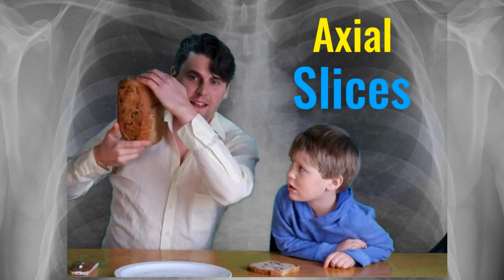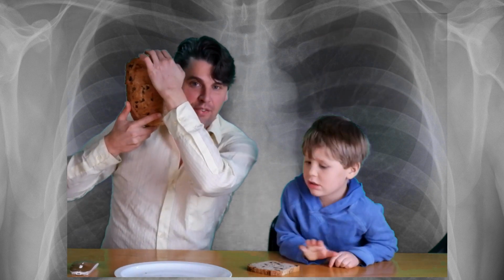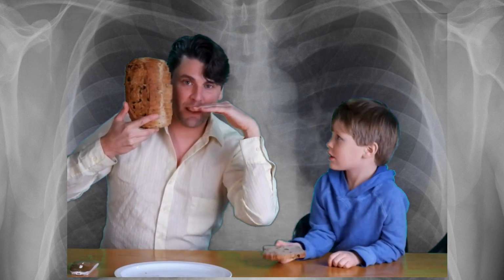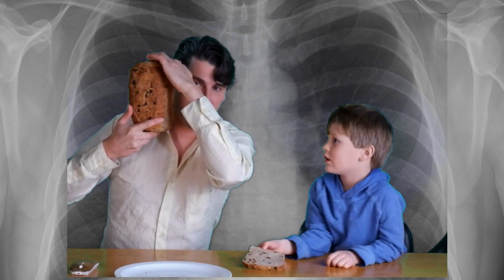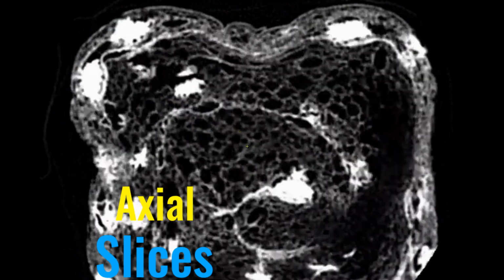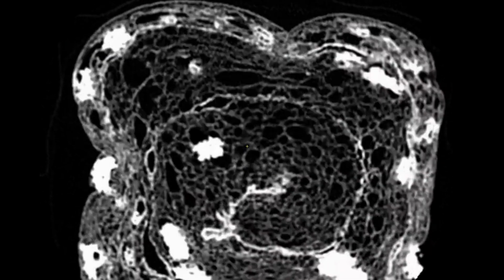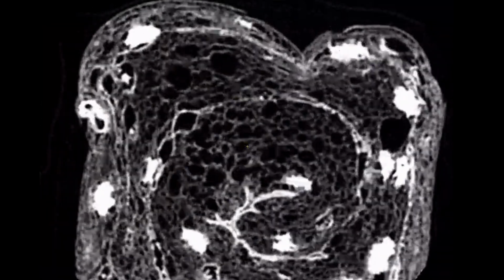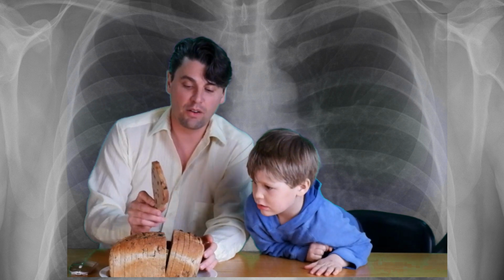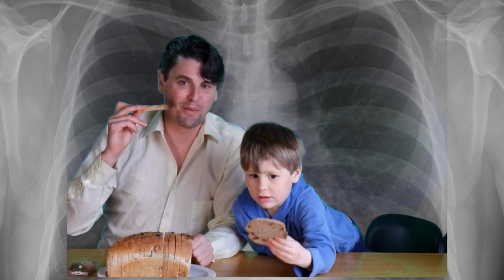So the loaf of bread is like in this orientation, and if you're looking at my head, these would be axial slices through my head, and we're typically going to show axial slices on our CT images. And any one image that's being displayed at one time is like one slice out of the volume, just like you could take one slice out of this loaf of bread.